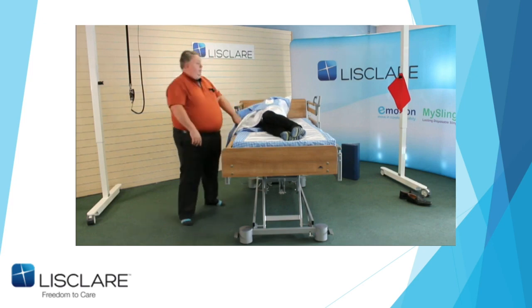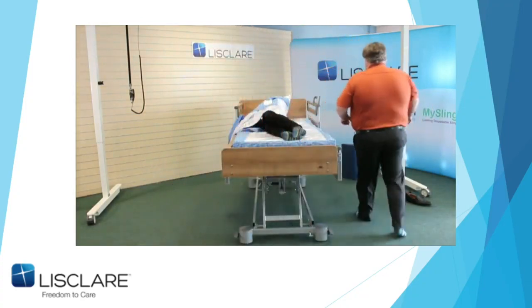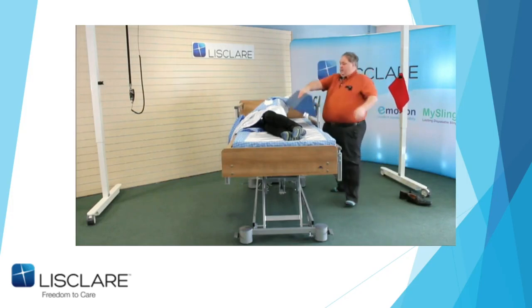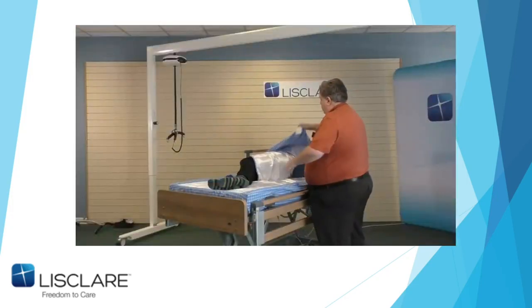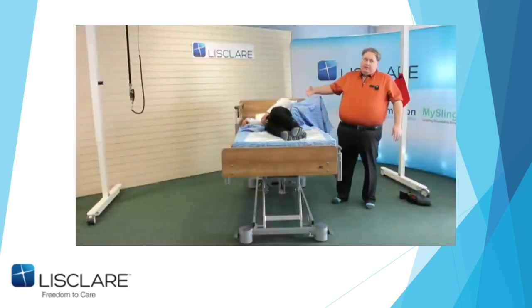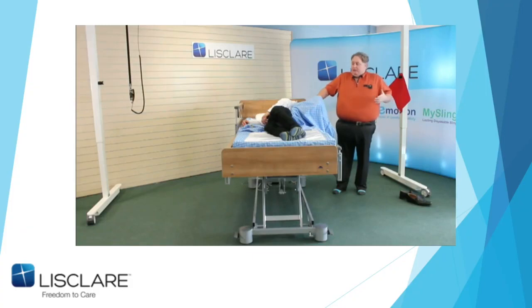If John stays there for a second, I'll be the second carer. Thank you, John. And at this point, I can put the sheet in. And John now can't get back, but yet I've got an access point to clean. So that's one way of doing a negative active patient, but again, I was on my own. If there was another person, you could be handing the sheet to them and you could double team up, okay?